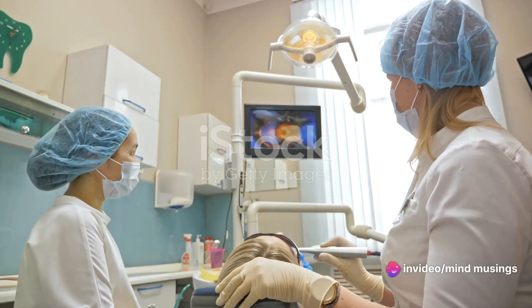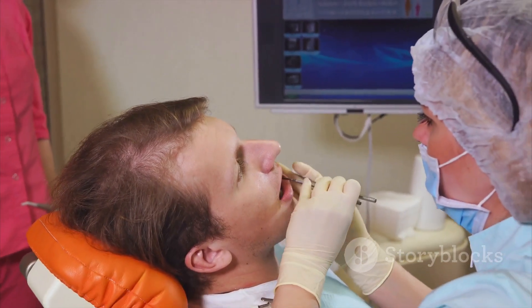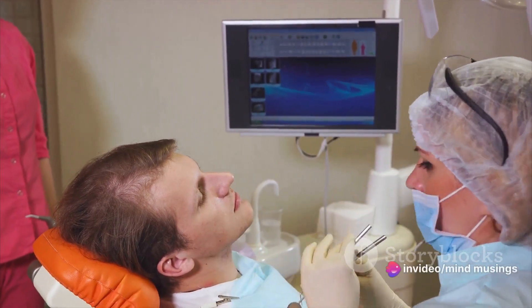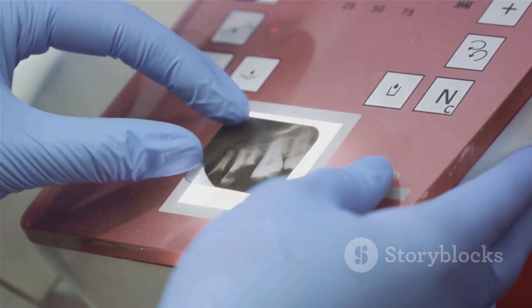The intraoral camera uses LED lights to illuminate the mouth, while the tiny camera captures the images. These images are then transmitted via a cable or wireless connection to a computer, where they are magnified and displayed on a screen. This allows your dentist to assess your oral health with precision and ease.